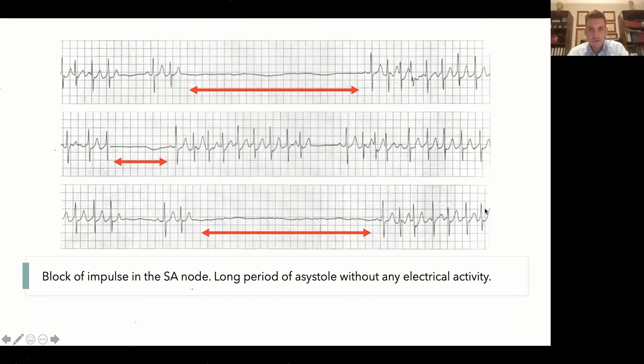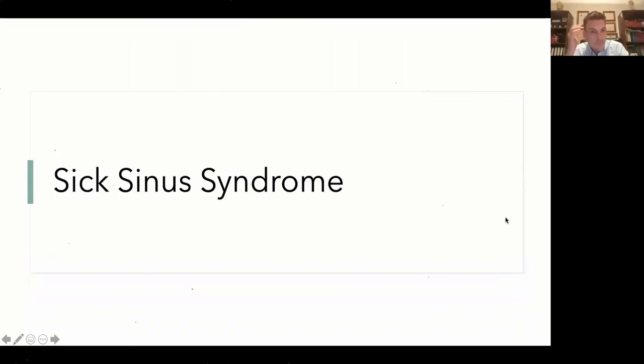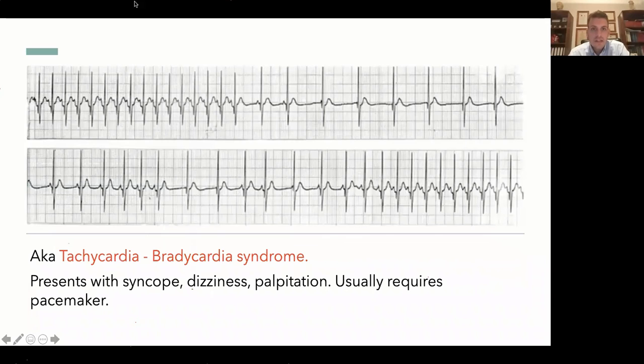So, okay. Sick sinus syndrome, okay? So, this is exchange of tachycardia and bradycardia at the same time while maintaining sinus rhythm. Sinus rhythm, positive P wave before every QRS. I'll keep saying this until I make sure you all know it, okay? Sick sinus, why?